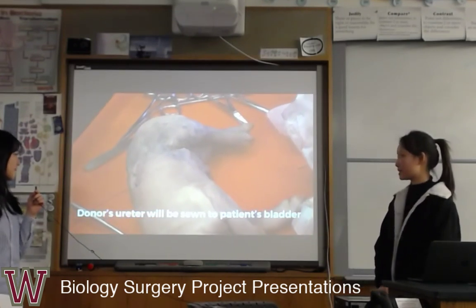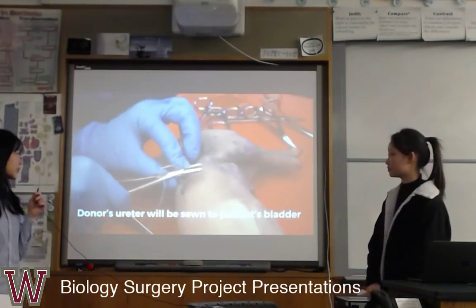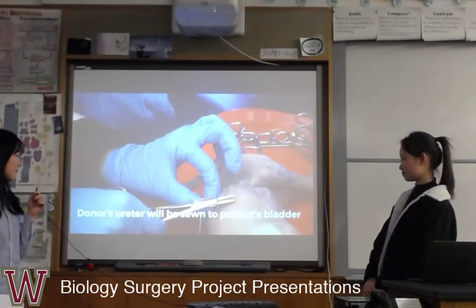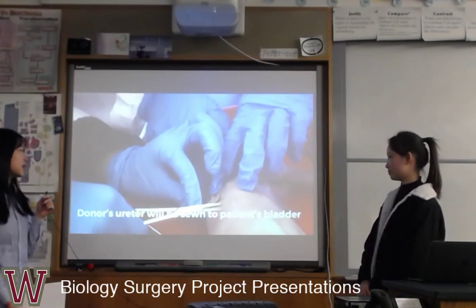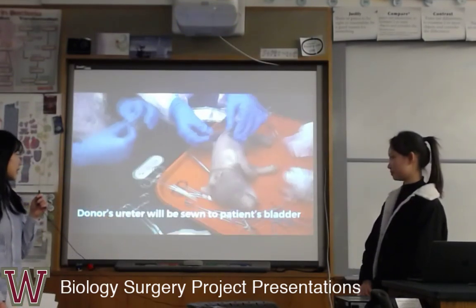And basically, that's the final step for the whole surgery. And we do this process carefully in case we stitch other organs.